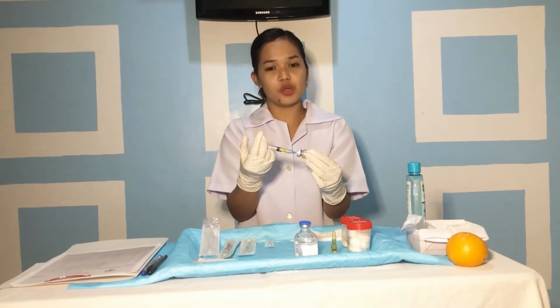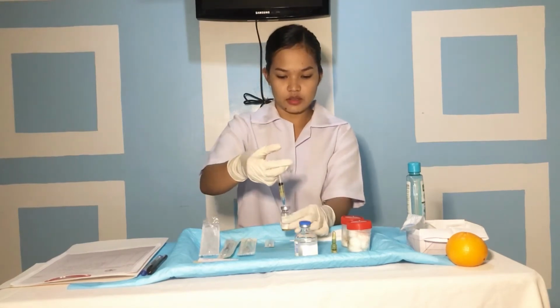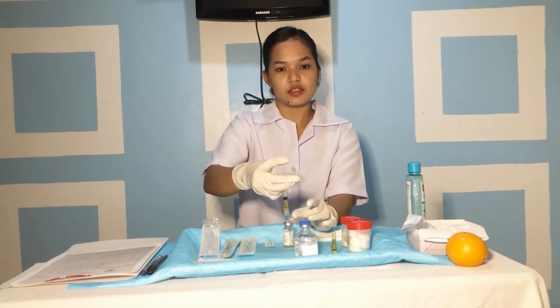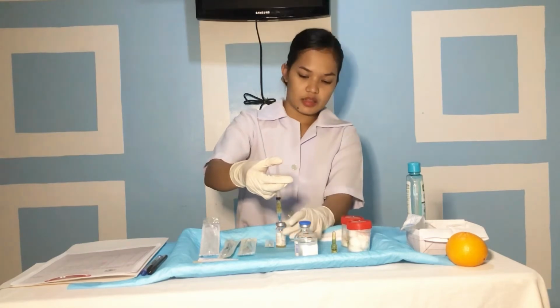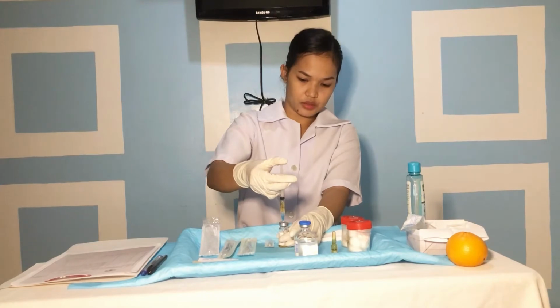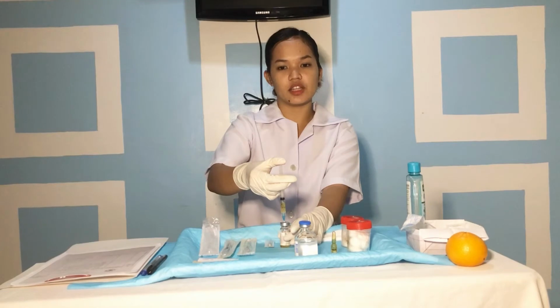When the desired volume is obtained, position the needle into the air space of the vial. We tap the side of the syringe barrel carefully to dislodge any air bubble and inject any air remaining at the top of the syringe into the vial. Forcefully striking the barrel while the needle is inserted in the vial bends the needle.